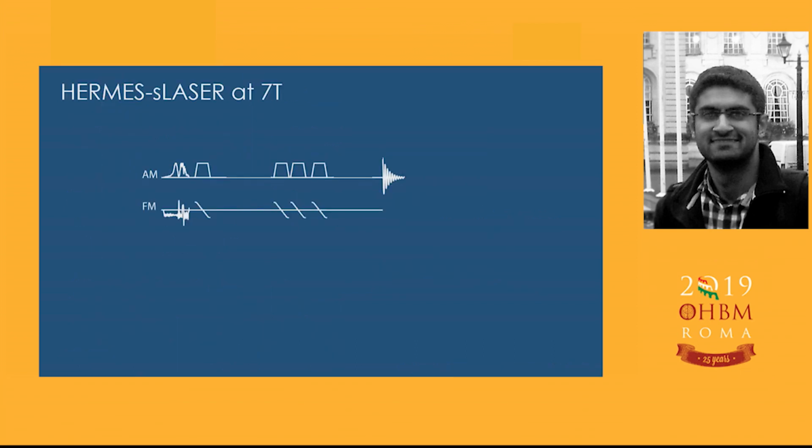So we can perform this at 3 Tesla. Question is, can we perform this at 7 Tesla? Performing editing at 7 Tesla has a couple of benefits. One of them is that you get higher signal-to-noise ratio data, and the second is that the pulse selectivity is better. So one way to reduce your macromolecule contribution is that you can perform the HERMES method, or you can go to higher field scanners, because the selectivity remains the same, but the dispersion in frequency increases, that reduces your macromolecular contribution in your GABA editing.